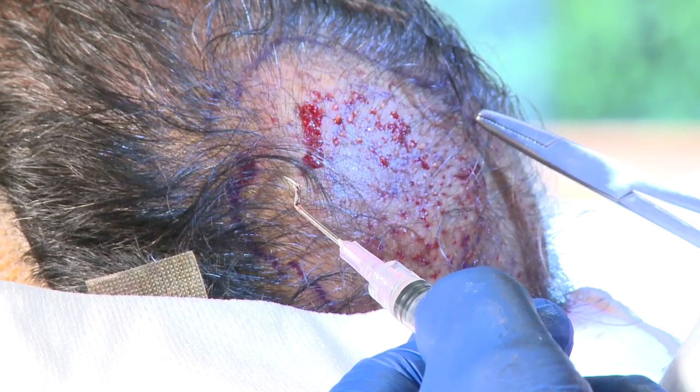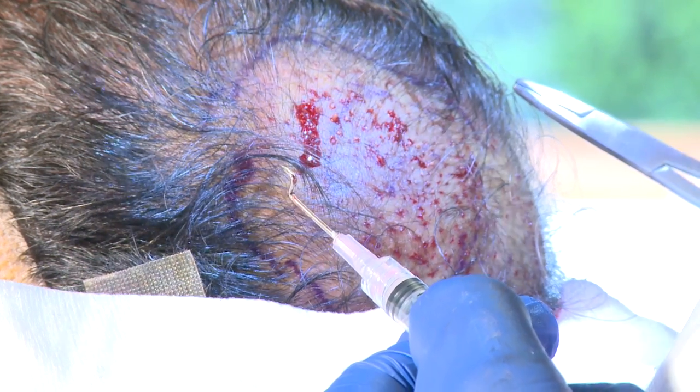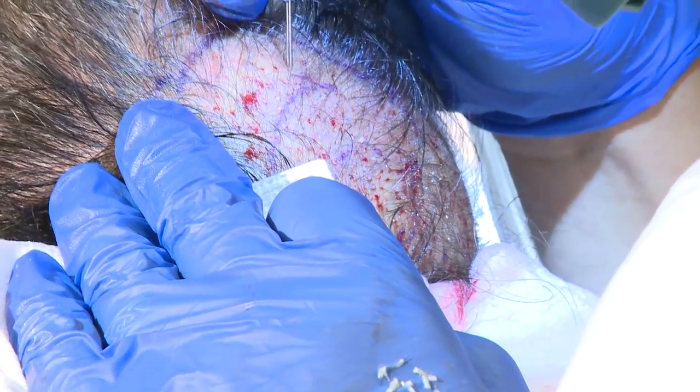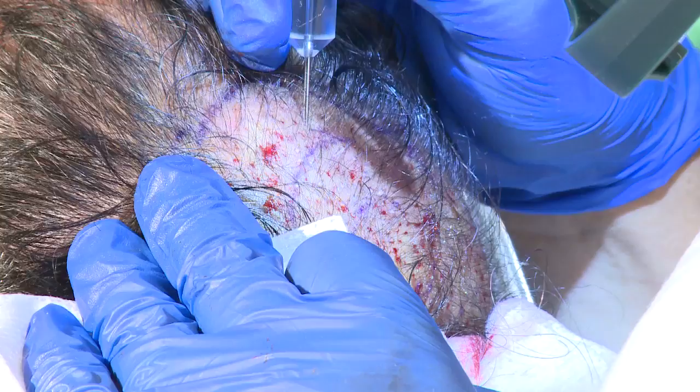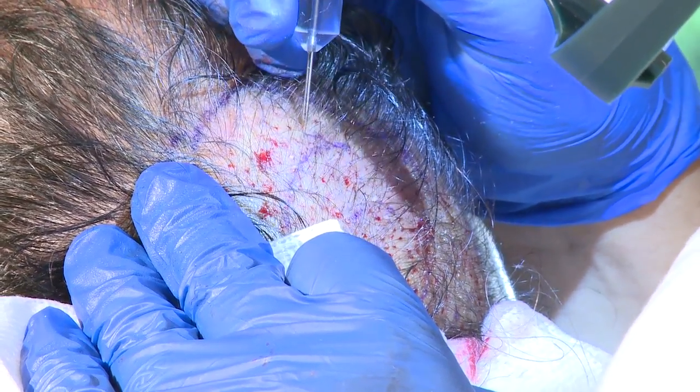That, within the next 7 to 14 days, will dry and slough off, and you're left with a nice smooth surface and a hair coming out. There it gets sucked in. I'm going to find me a slit, place it next to the slit, drag it over, in effect opening it, and place the graft inside.